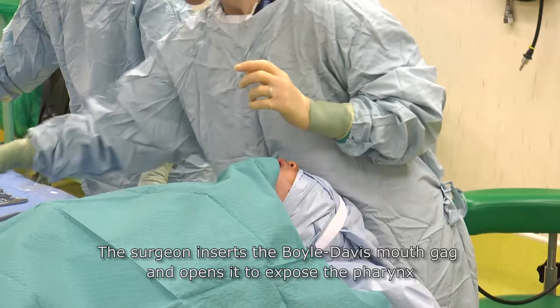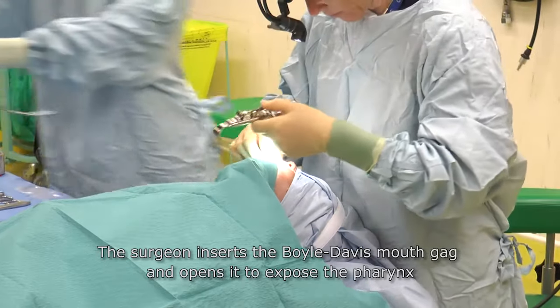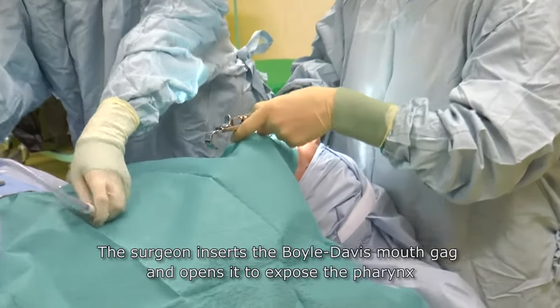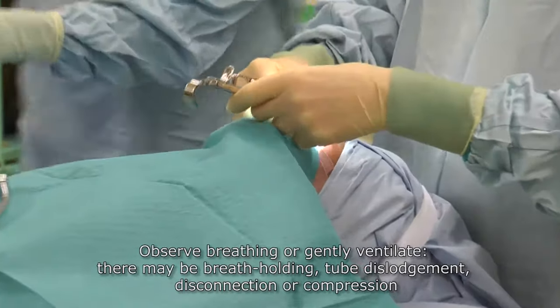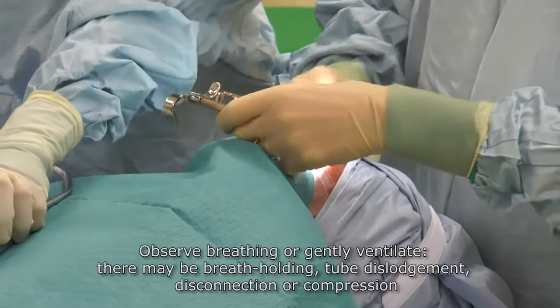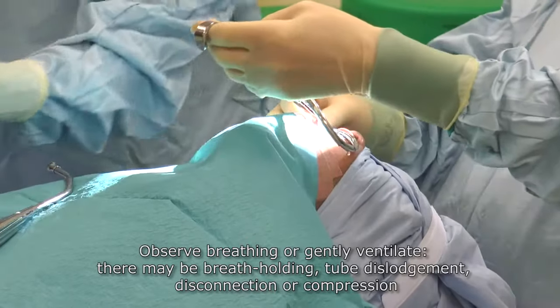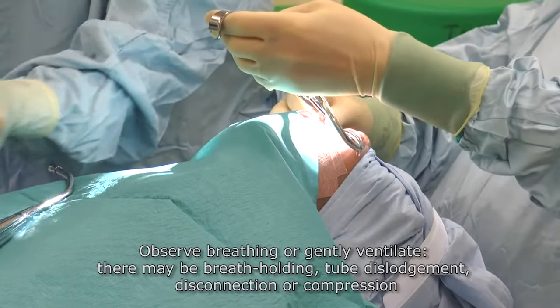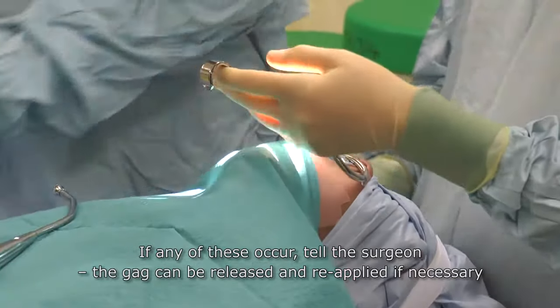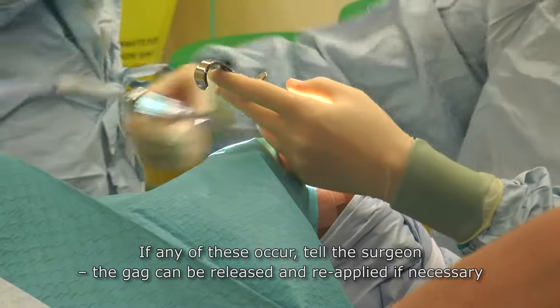The surgeon inserts the Boyle-Davis mouth gag and opens it to expose the pharynx. Observe breathing or gently ventilate. There may be breath holding, tube dislodgement, disconnection or compression. If any of these occur, tell the surgeon — the gag can be released and reapplied if necessary.